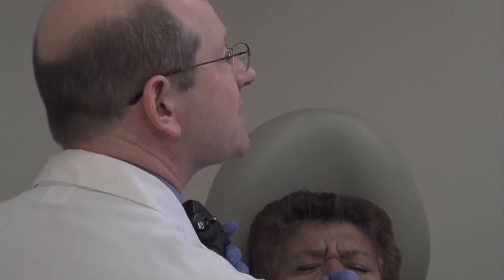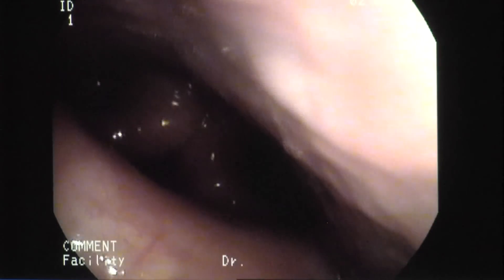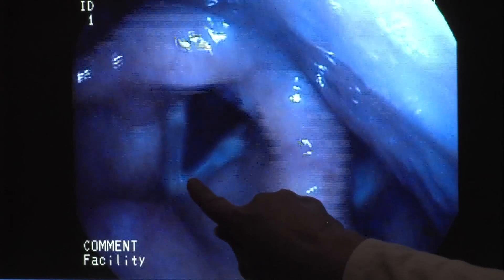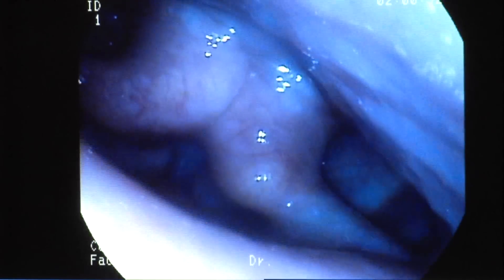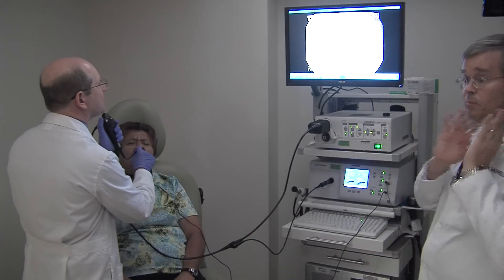Look at those vocal cords — that's what we want to see. Say 'ah' — beautiful, clean vocal cords. Say 'e, e, e.' Say 'ta, ta, ta.' So the nerve is working well on both sides.